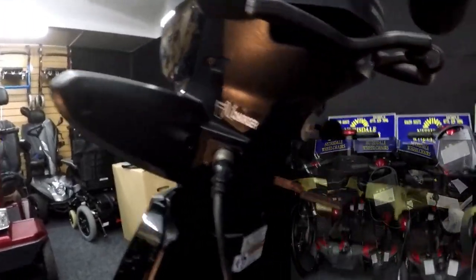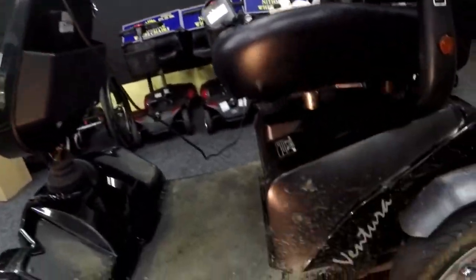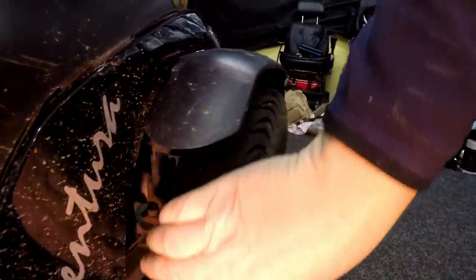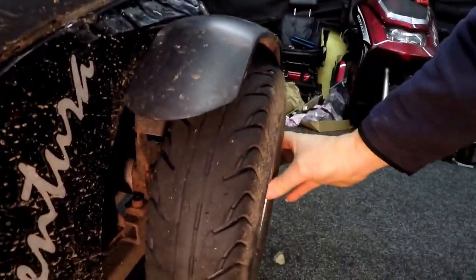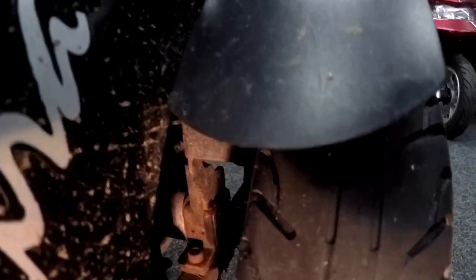Also, another problem, she said she's having a lot of noise coming from the back end. Now, if you have a wee look here, this is the back wheel. The wheel has had it, by the looks of things here. What's actually happened, if you see in there, you'll see the grease coming out of the transaxle. The bearings are gone inside the transaxle, and the only way to repair that is to fit a new transaxle.